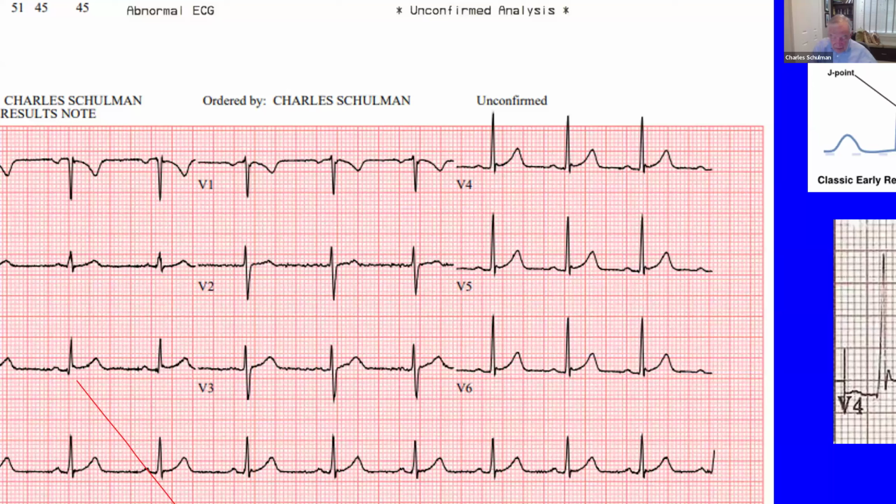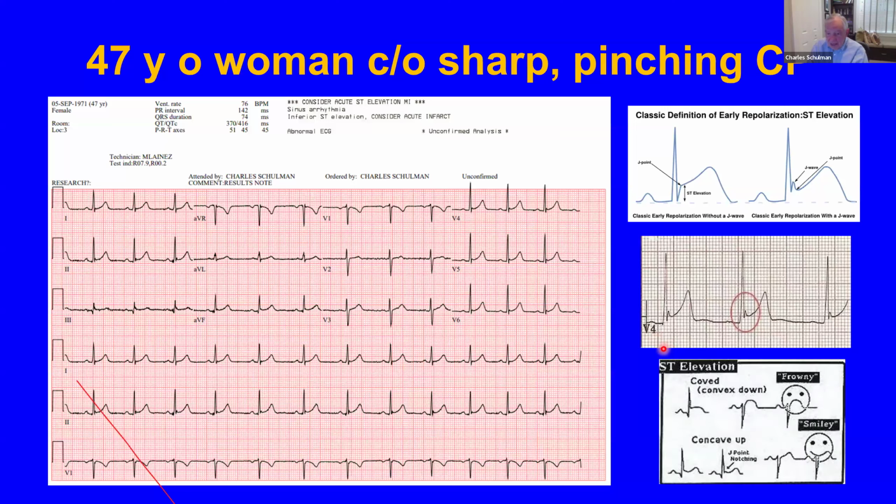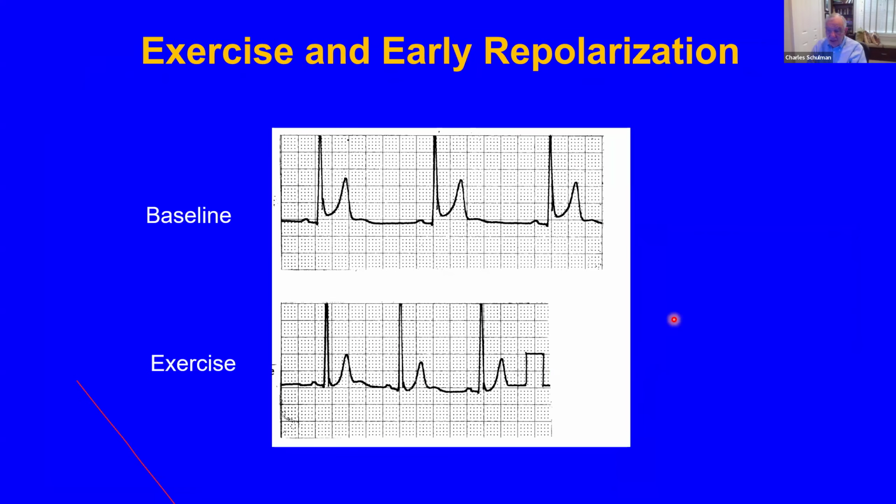In addition to which, this is a smiley face. The ST segments are smiley face, not frowny face. They're concave up, so that is not an acute ST elevation MI. This is the early repolarization abnormality. We did not send her to the emergency room. Just of note, if you exercise a patient with early repolarization, it improves.